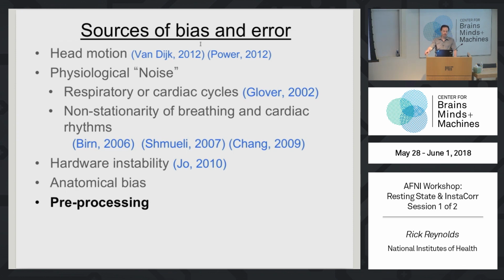well, people started talking a lot about head motion in 2012. Head motion was dealt with all the time before then, but suddenly it became a big deal with the paper written then, telling people you should be censoring and things like that. Though really we've had censoring in our linear regression since 1988.